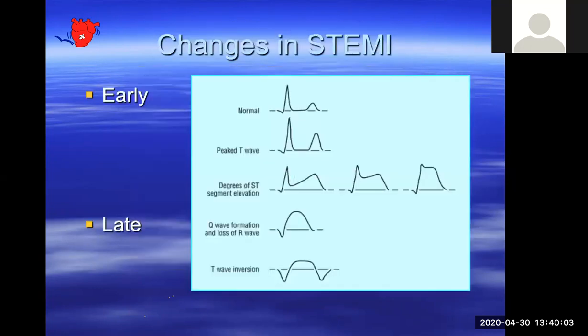What about ST segment elevation? Elevation usually is a marker of myocardial infarction. Regarding the changes in acute myocardial infarction, as you probably know, the earliest sign is actually peaked T waves. So if somebody comes with acute chest pain and you have big tall T waves in, say, the anterior leads, then this patient probably has an early anterior myocardial infarction. That's followed by elevation of the ST segment, and then probably Q waves and later T wave inversion. Maybe that's the time sequence of the events.